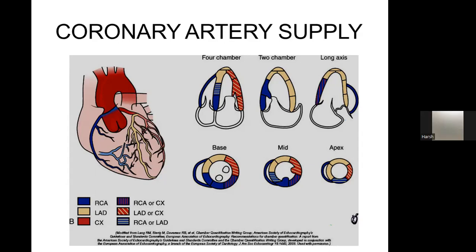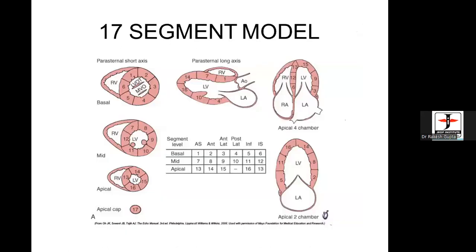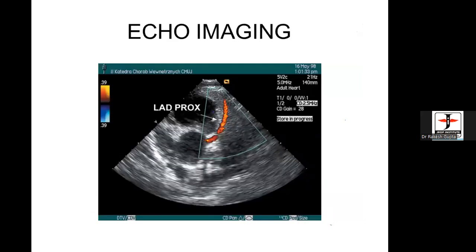Sir, not this. Obtaining the coronary artery view. The last image. Coronary artery view. Wait for some time. Wait for about 10 years. At least 10 years. That was just teasing you, because with every echo, you will learn something new. That is my take on this.